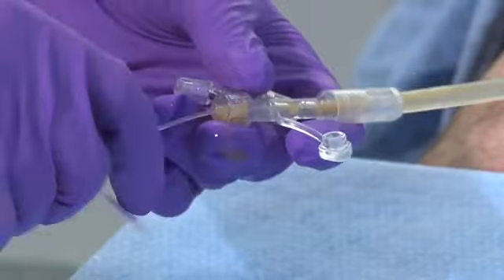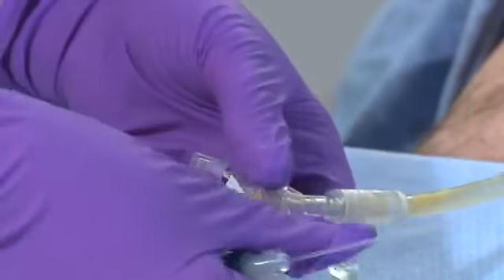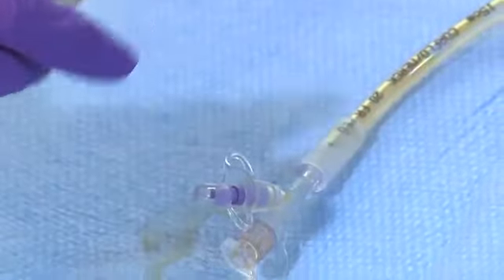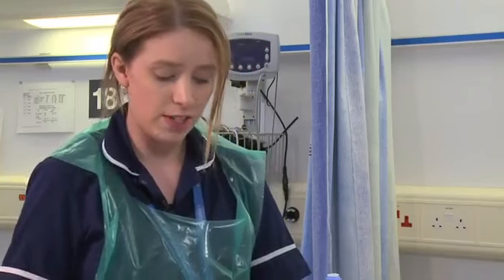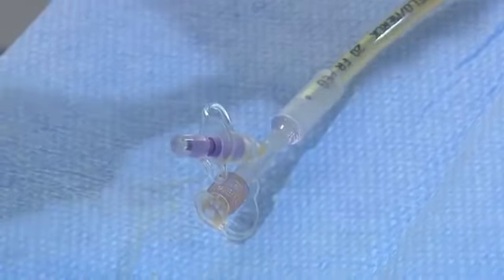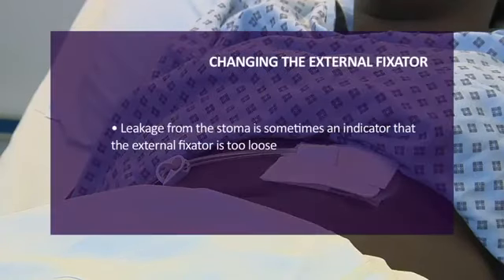Okay, so once we've injected that, we can take the quill out and cap off the end. That needs to stay inside the tube for at least an hour, and then we'll come back and try and flush it again and try and unblock the tube. Once this has been reconstituted, it can be kept for up to 24 hours, but obviously it should be labelled for that single patient.